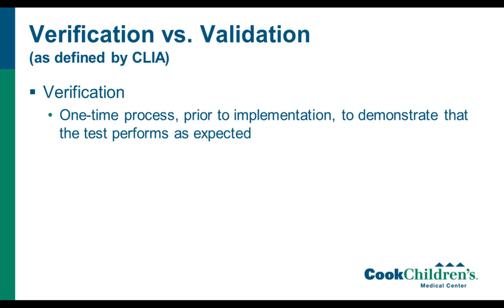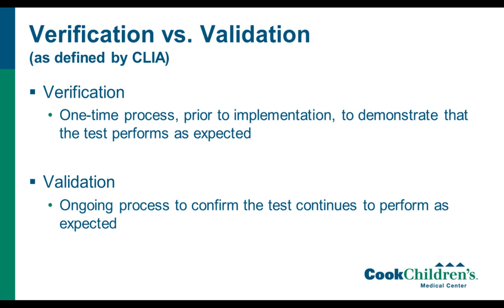So let's define verification and validation. And this is actually a little bit confusing because different groups have different definitions. So as defined by CLIA, or the government, verification is a one-time process prior to implementation of the assay where you're demonstrating that the test performs as expected. And their definition of validation is an ongoing process to confirm that the test continues to perform as expected.